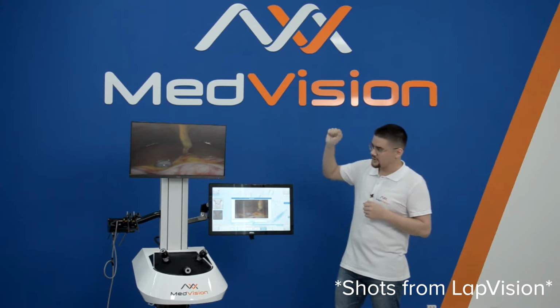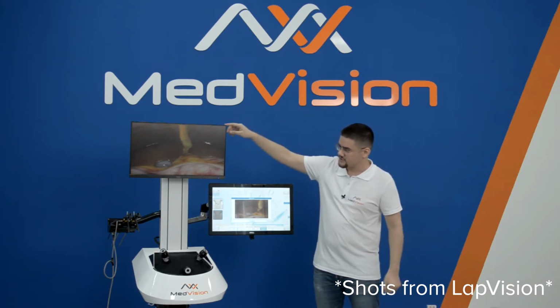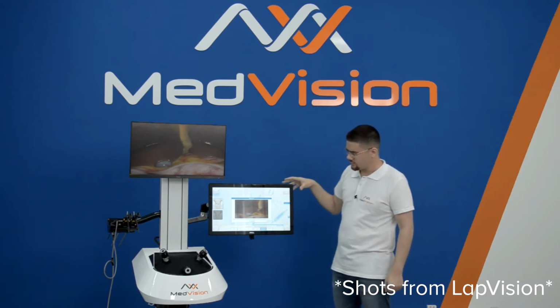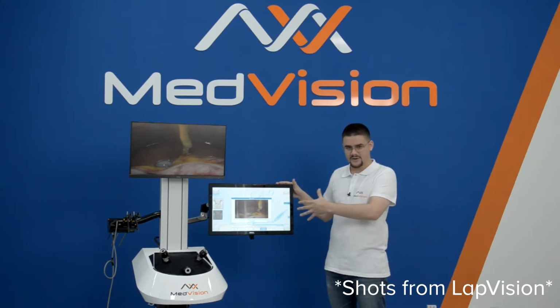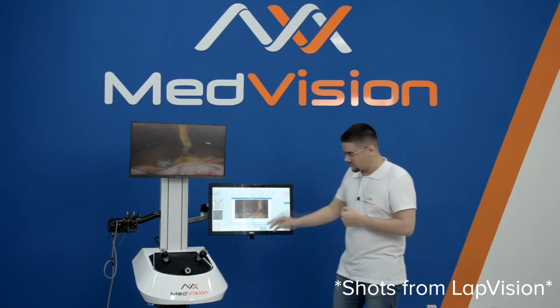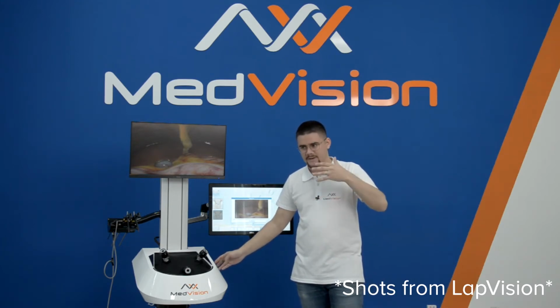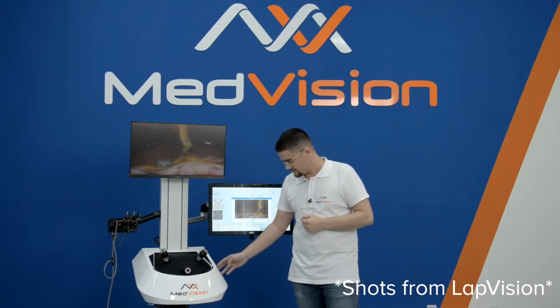On the frame we have 2 Full HD monitors, one of them for your visuals with an anti-glare coating for improved imaging, and the one on the right hand side is a touch screen, and the menu controls are optimized for touch input. Here we have height adjustment, and the range of height adjustment is very broad, suiting taller and shorter trainees. Let me demonstrate to you.